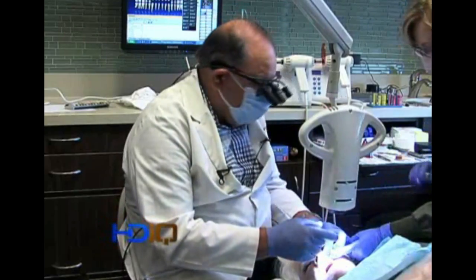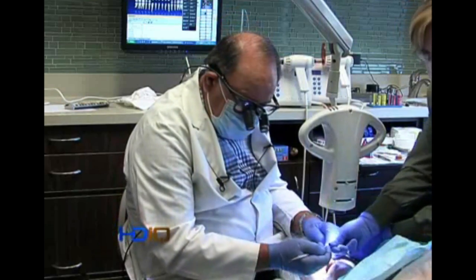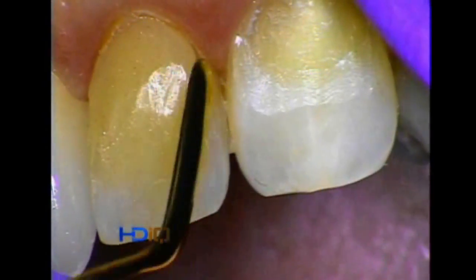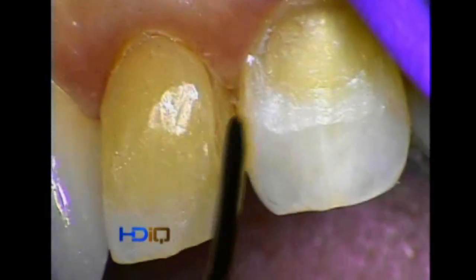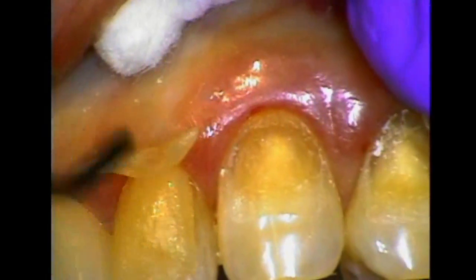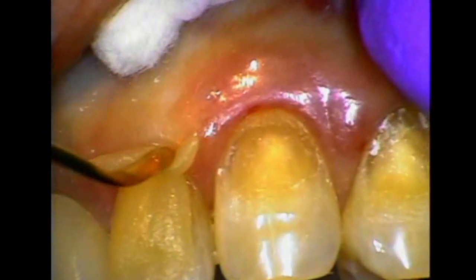I'll switch to a really fine-bladed instrument — an IPC short-bladed instrument, it's almost like a razor blade — and you can bring this material into the interproximal. I'm going to use this material to close down these margins completely.